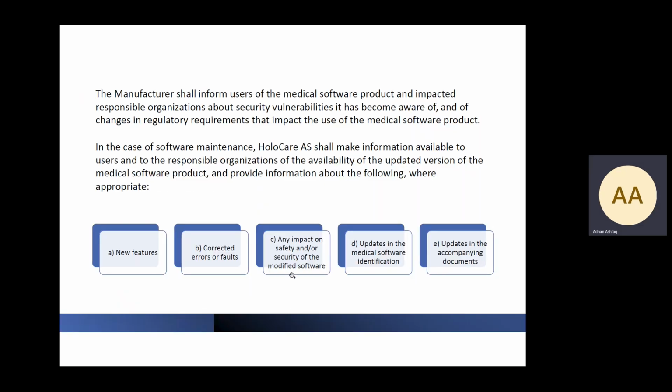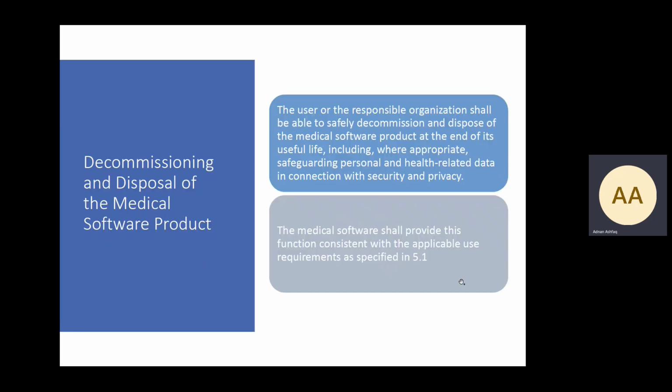So post-market activities, as you can see, there are these different elements which need to be followed: new features, corrected errors or faults, any impact on safety, updates to the medical device software, and updates to accompanying documents. Decommissioning and disposal of the medical software product.